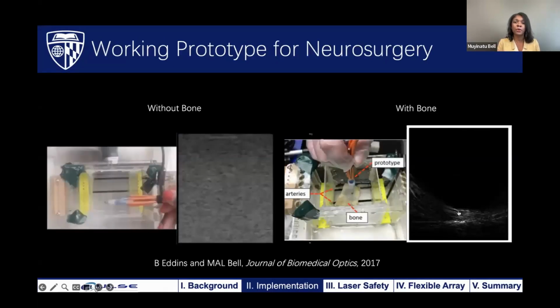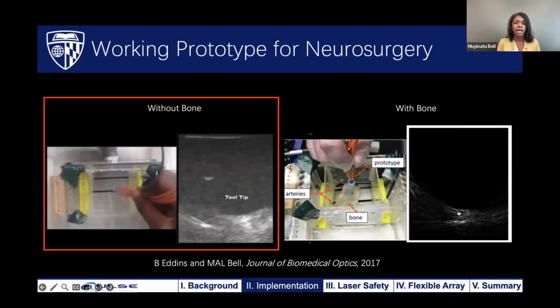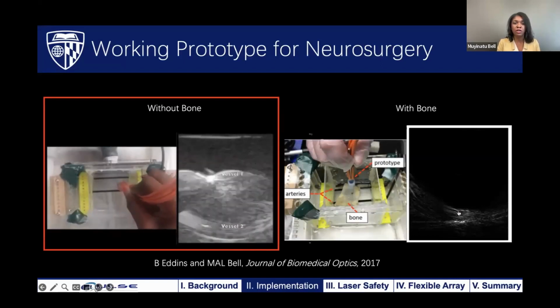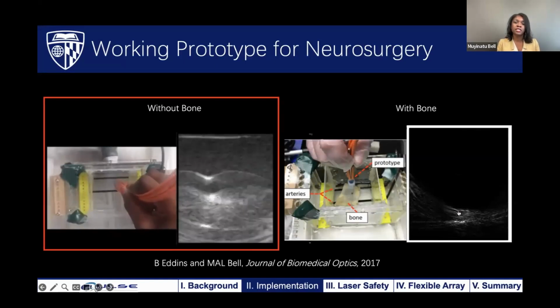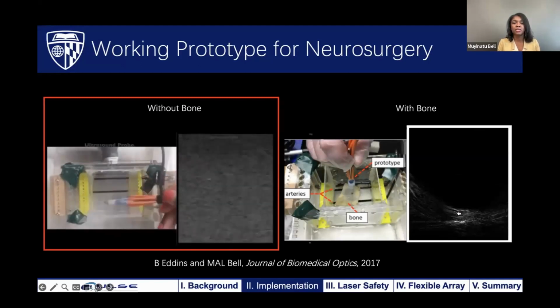And this first working prototype was demonstrated for neurosurgery, where in this surgery, I hold a prototype and enter a mock surgical environment. And the two black lines that you see represent internal carotid arteries, or vessels that we don't want to injure. And you can see how close the tooltip is relative to these vessels that I don't want to injure, just as I'm navigating around. And you can appreciate this linkage by looking at the videos, but in a real surgical environment, the structures that we want to avoid are hidden.